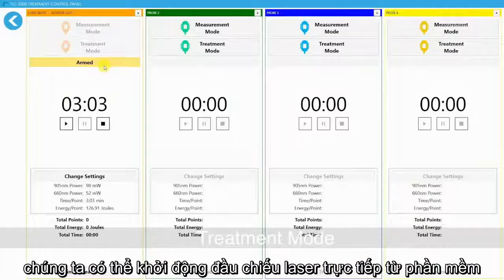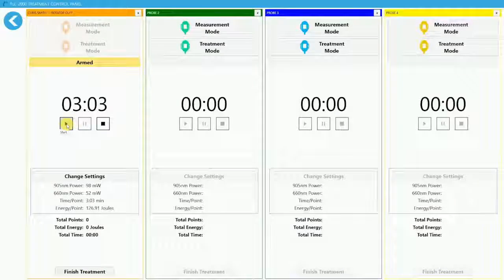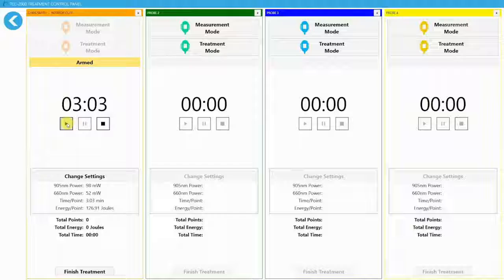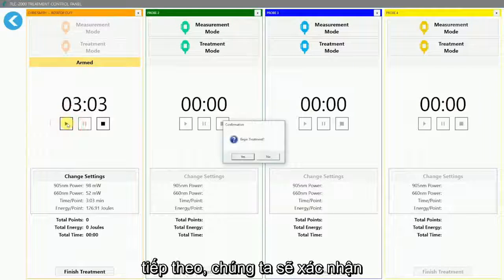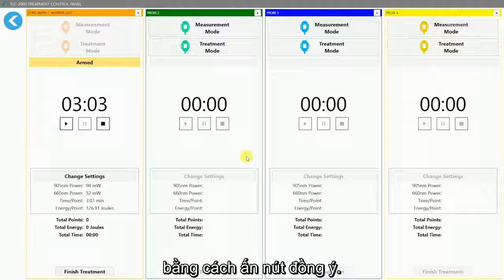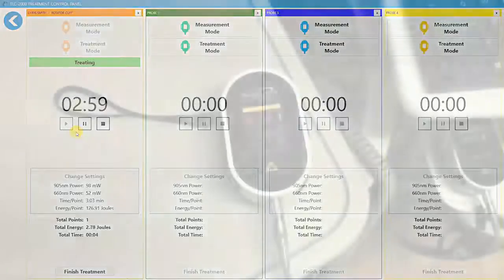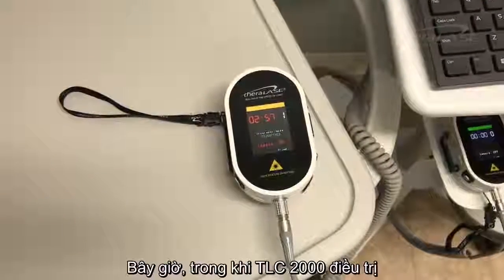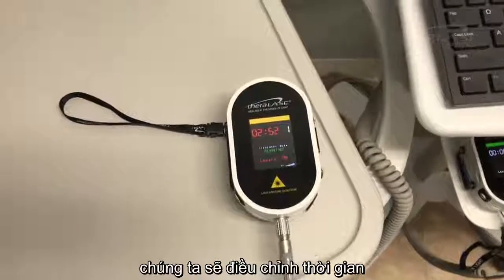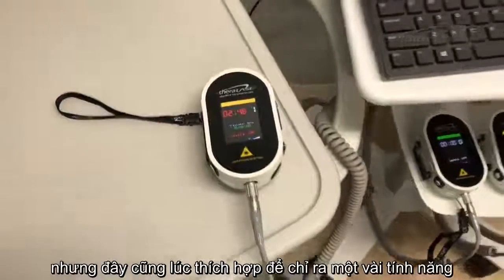We can start the laser probe directly from the software by clicking on the Start button, or on the little black push button on the side of the laser probe. Click Start. Then we're going to confirm that we're ready to begin treatment by clicking on Yes. Now, while the TLC 2000 is delivering treatment, we will edit down the treatment time for presentation purposes, but this is an opportune moment to point out a few features.